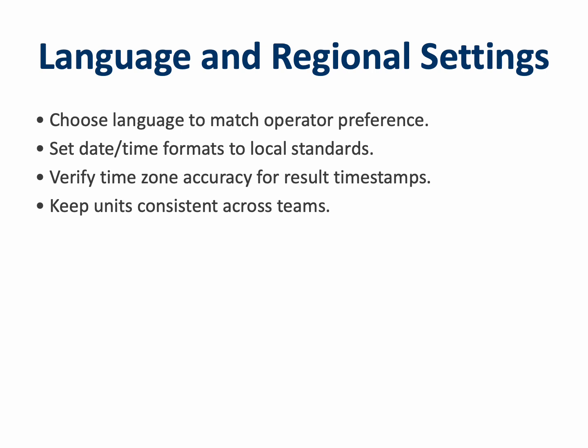Ensure the time zone is correct, especially if the analyzer travels between sites. Finally, maintain consistent measurement units, amps, volts, ohms, across all devices to keep results interpretable between departments.